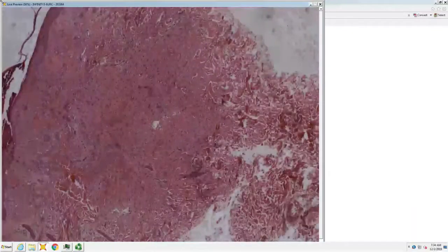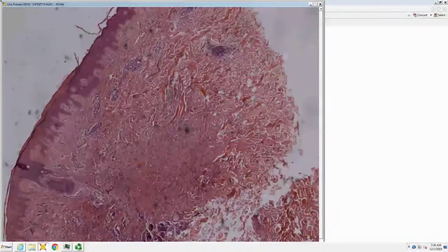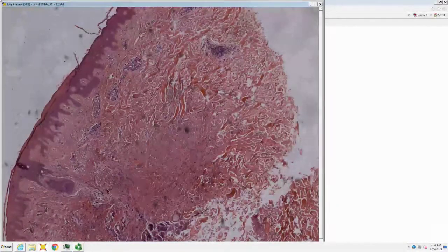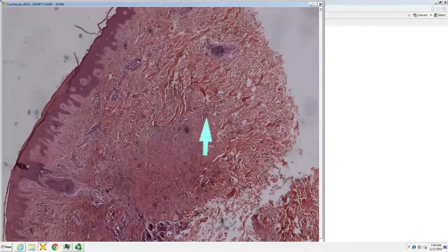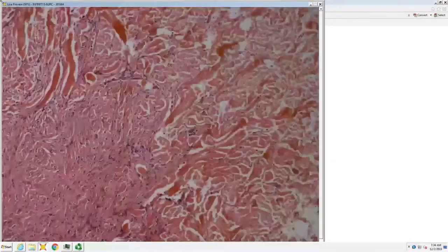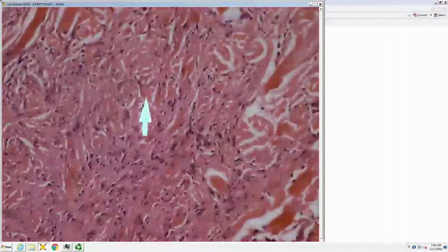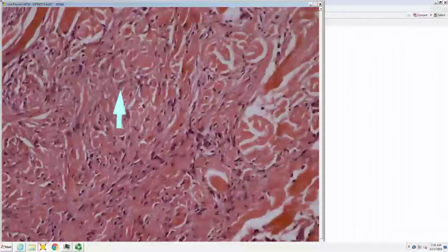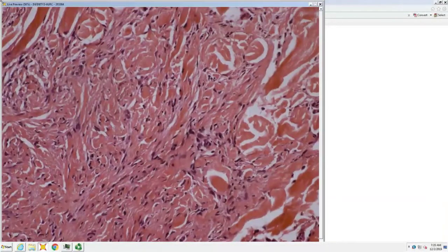So dermatomyofibroma is a reasonable thought because the eccrine glands are a little preserved. This particular example, though, has very prominent collagen balls at the periphery. And so you want to look at the pattern. If you have red balls with curved black nuclei, the black dolphins jumping over those red beach balls, then it's probably just a dermatofibroma.